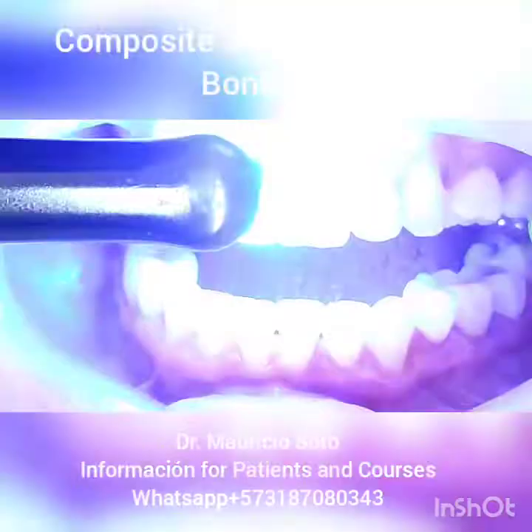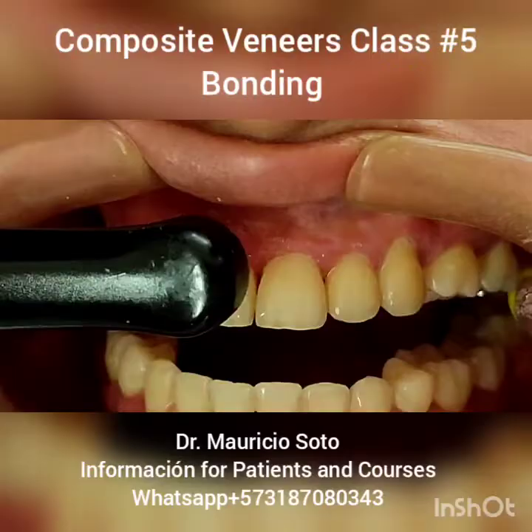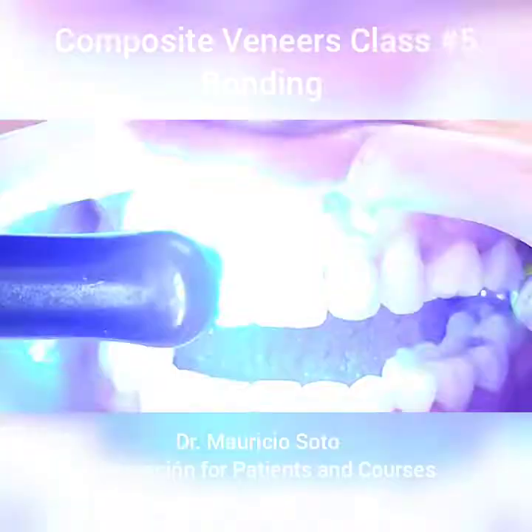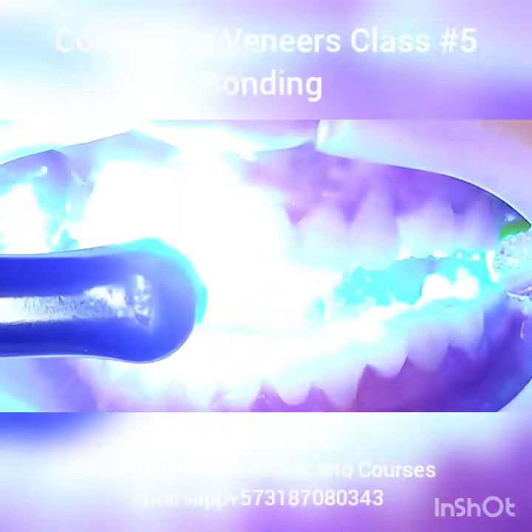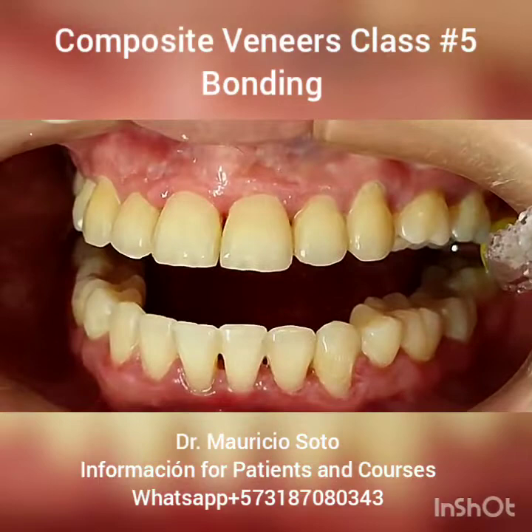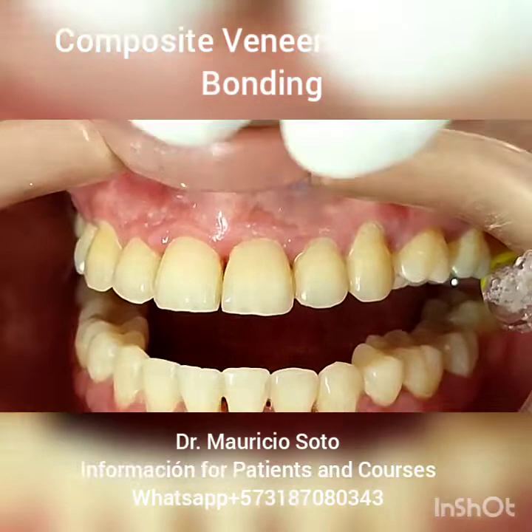It's very important to use the photocuring light with a good lamp. If you don't photocure the bonding, you don't have good bonding. Many times people forget to photocure the bonding and put the composite without photocuring — and after a short time, they lose the veneer. This is the way it looks after bonding, and at this point it's ready to start the buildup of the veneer.